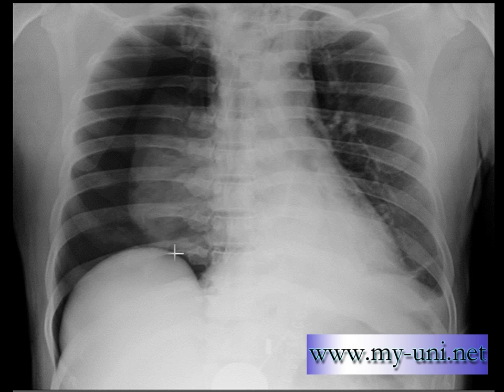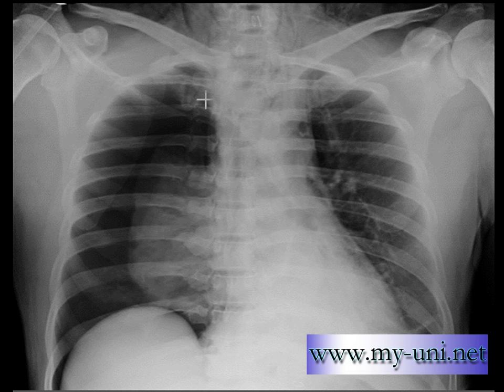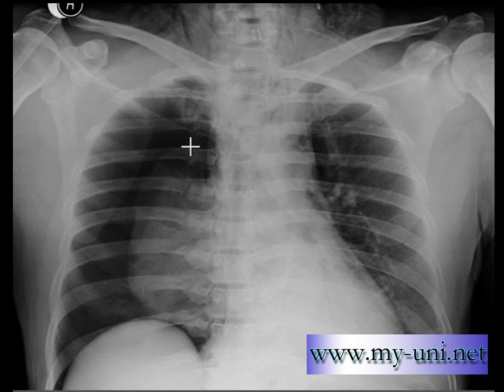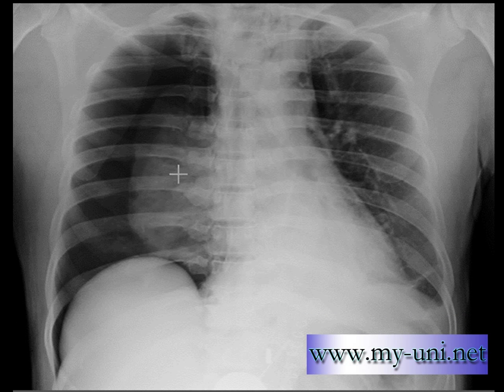The only reason I believe this is a supine X-ray is because of this sharp shadow going too far deep. This is quite a big pneumothorax. If the X-ray was taken in erect position, you look for the pneumothorax at the apex. If the X-ray was taken in supine position, you look for the pneumothorax in this anterior area, because in supine position this is the highest point.